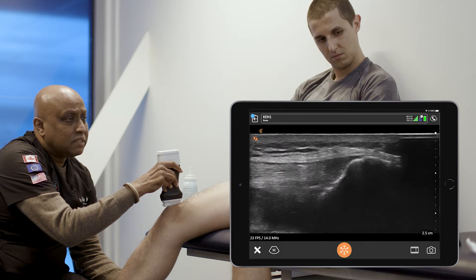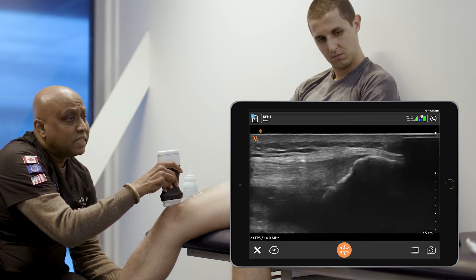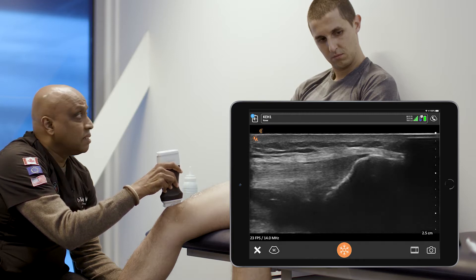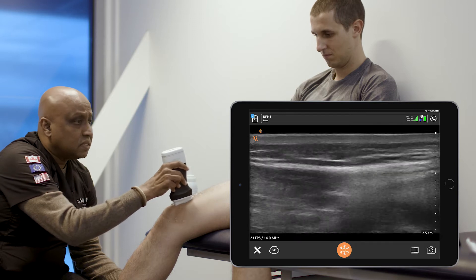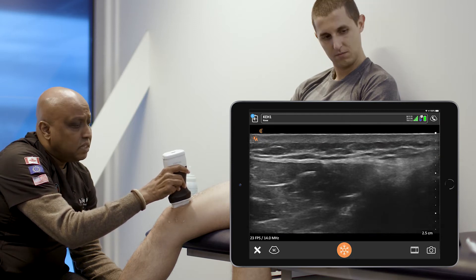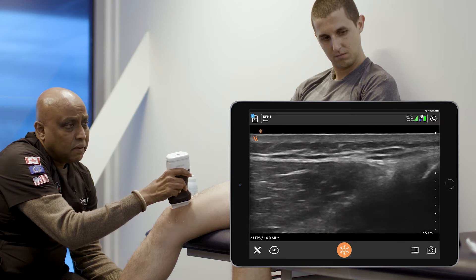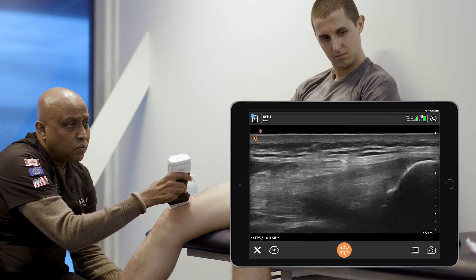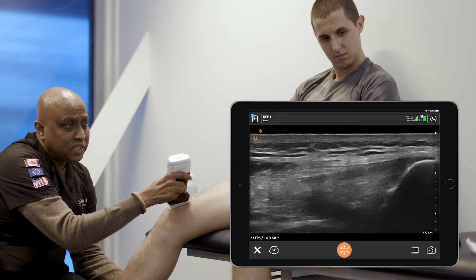Because at times, as a coach and trainer, there are requirements for them to go onto the ice with their athletes. So this is fine. I'm going to go side to side, scanning the medial aspect. No overt signs of pathological changes.